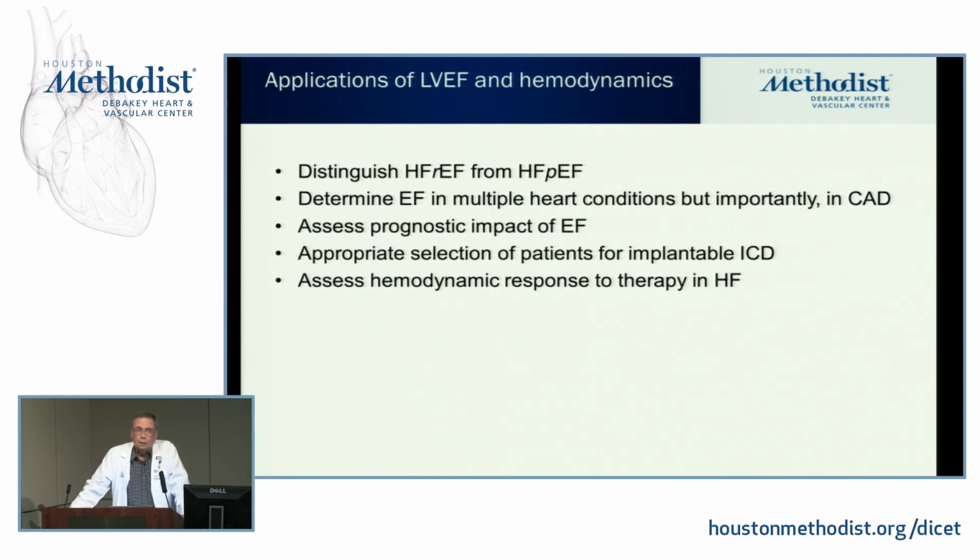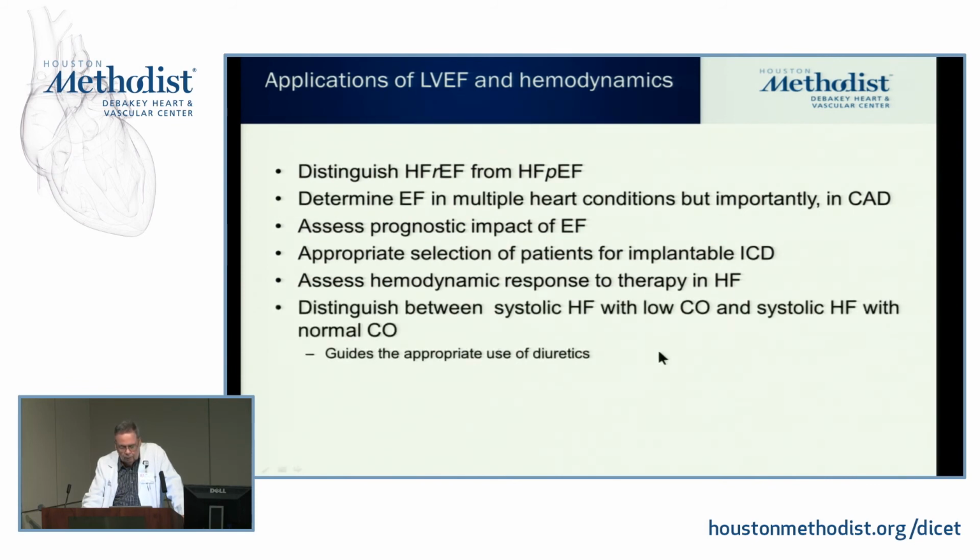What we can see, and we have lots of examples in our teaching files, are drastic changes in filling pressures and PA pressures and cardiac output. So if we're going to do an echo in a patient coming back with heart failure, let's do it for hemodynamics more than EF, because EF seldom changes. And of course, this is very important.